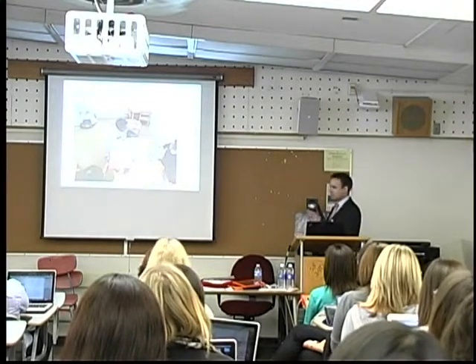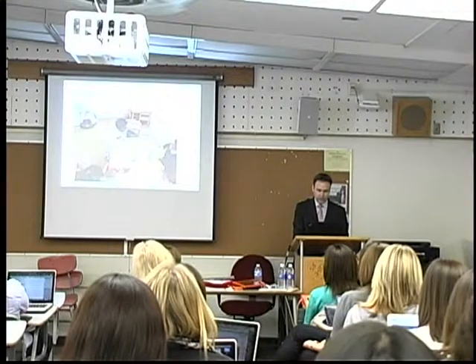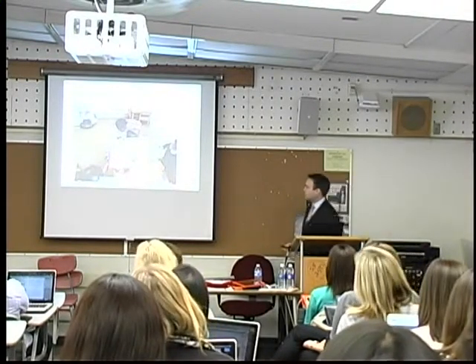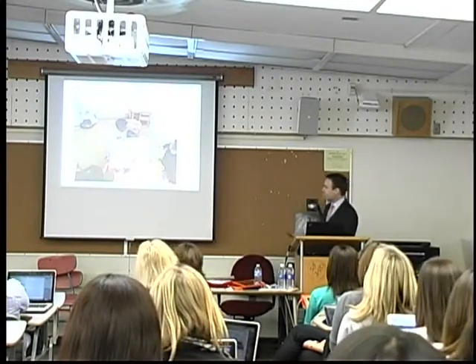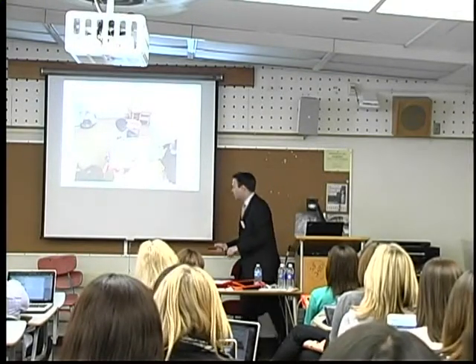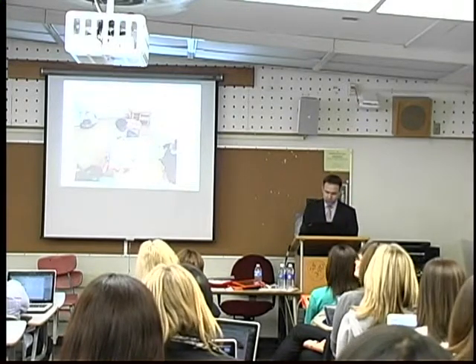And here's this little boy again that you saw earlier in the autism diagnostic evaluation. This is his behavior during baseline. You will see that he has not mastered the device, neither has he mastered the regular PECS approach. He will grab and reach for items that are inside, as he did earlier this morning in the diagnostic session.